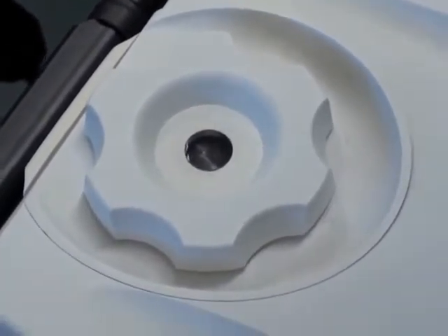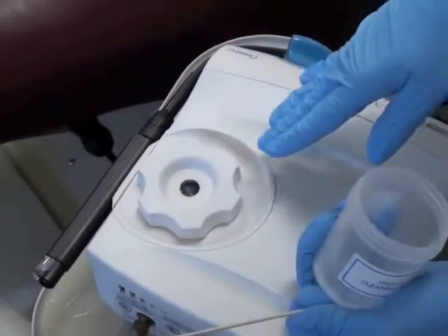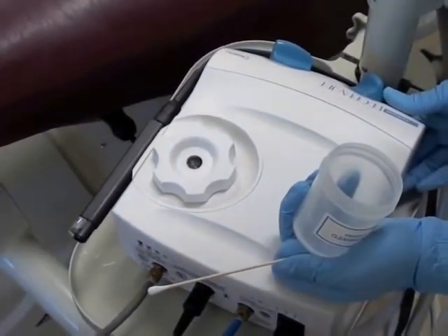Before this occurs, you want to make sure that you turn the unit on and allow all the air to come out of that hole to dislodge any hardened pieces of powder.